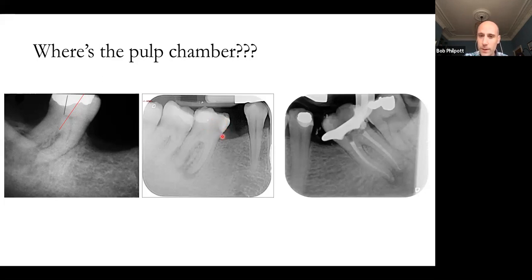And if you come out at this point, it makes it a much, much more complex treatment than if you don't. And interestingly, two things have happened here. Look at the orientation of the tooth. It's just kind of off angle, isn't it? It's just sitting in a slightly, because it was a mesial tilt. And equally, it's heavily restored. Lots of composite up on top, and that composite looks to be nicely contoured. Okay, this is one of the things that is slightly counterintuitive, but it's nicely contoured.